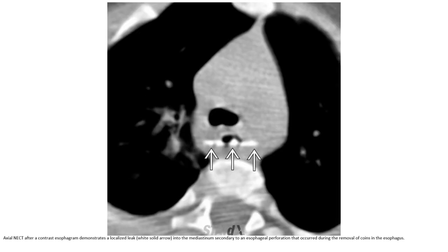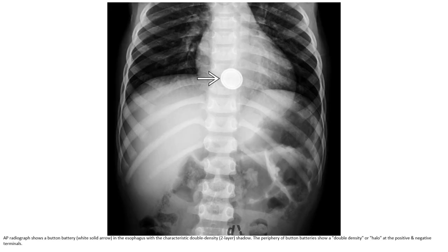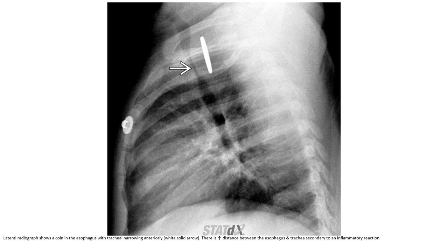Non-contrast and CT after contrast of the esophagus demonstrated a leak into the mediastinum secondary to a perforation that occurred during the removal of a coin in the esophagus. AP radiographs show button batteries in the esophagus with characteristic double density shadow. The periphery of button batteries shows higher density or halo and positive step-off sign. Radiographs also show a coin in the esophagus with trachea narrowing anteriorly, and there is a distance between the esophagus and trachea secondary to an inflammatory reaction.